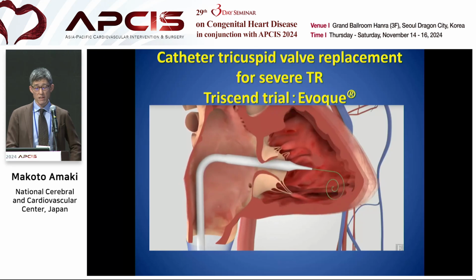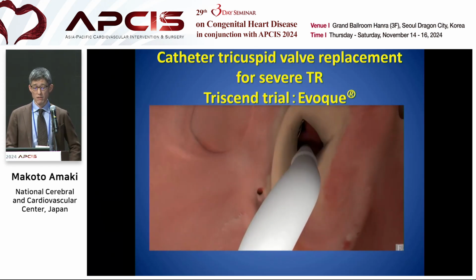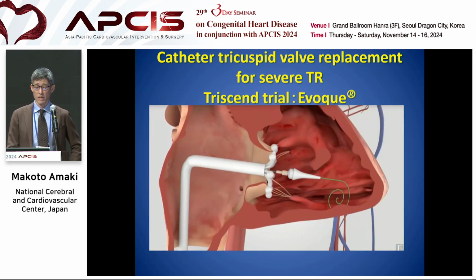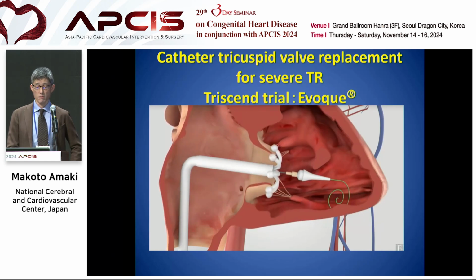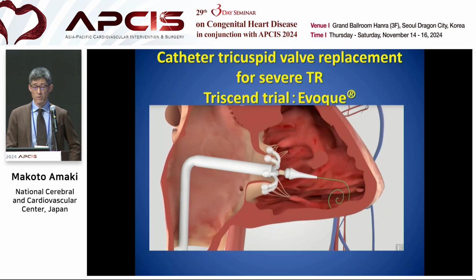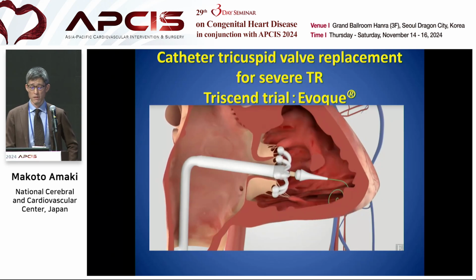Lastly, there's tricuspid valve replacement therapy, and Evoque, produced by Edwards, is the device that is also waiting to come to Asia. We have done the TRISCEND trial in Japan as well. We have done 10 cases in our institution.